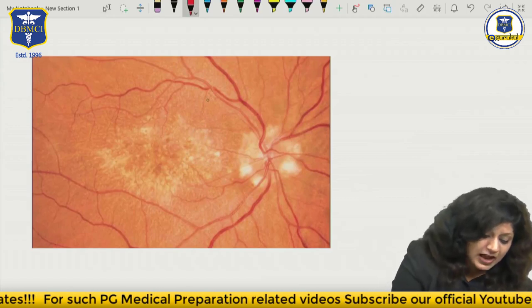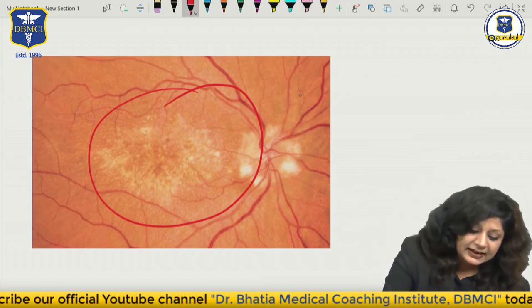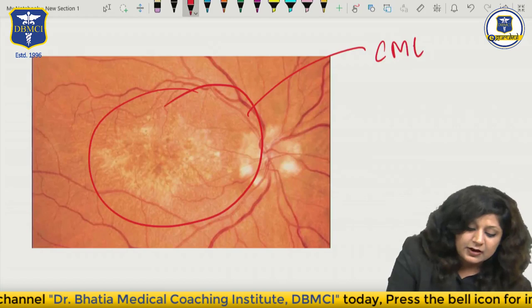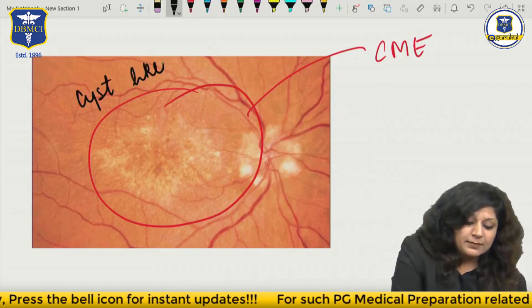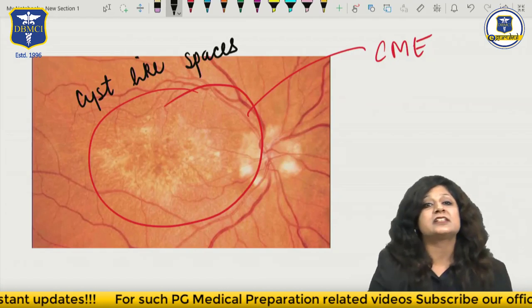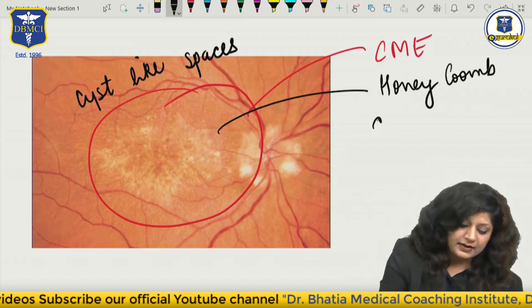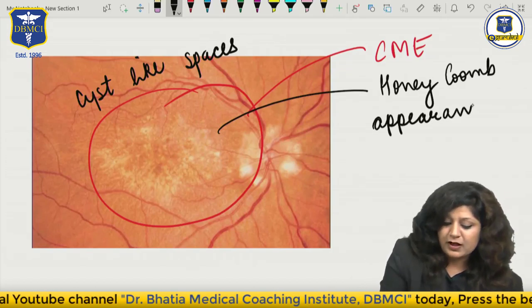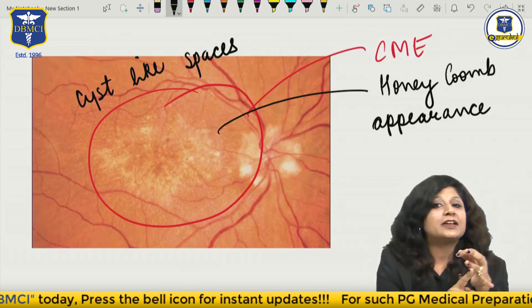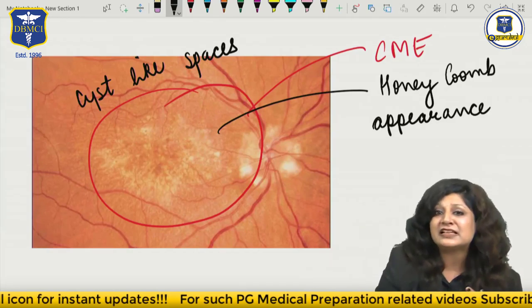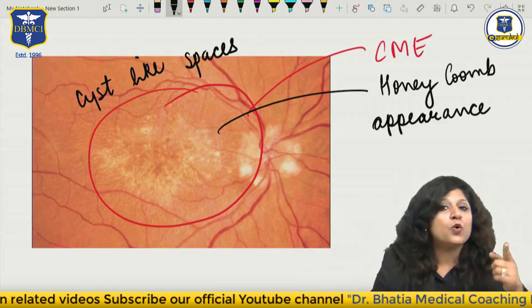When you are able to see the honeycomb spaces - honeycomb appearance in the fundus - that means it is CME. Why do we have honeycomb appearance? Because we have cyst-like spaces. These cyst-like spaces present in the fundus give a honeycomb appearance. So honeycomb appearance is found in patients of CME. You have seen the difference in OCT, the difference in etiology, the difference clinically, and now the difference in the fundus - one is a circular ring sign and another is honeycomb appearance.